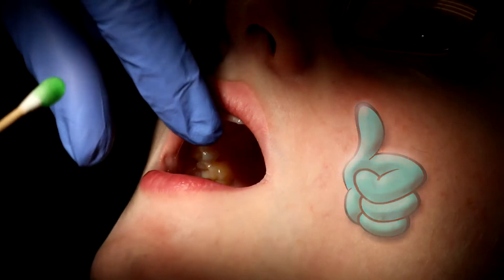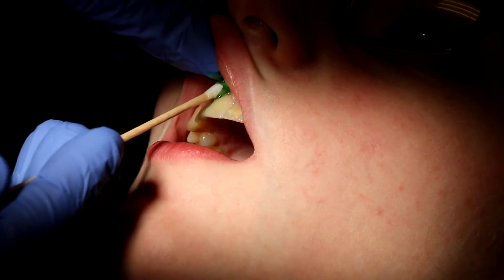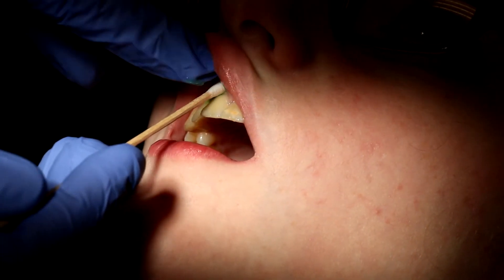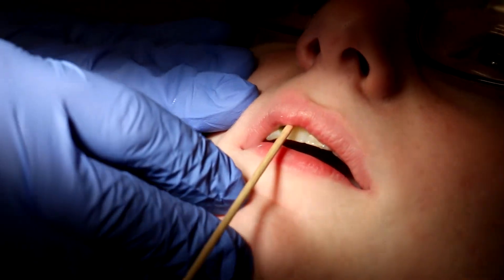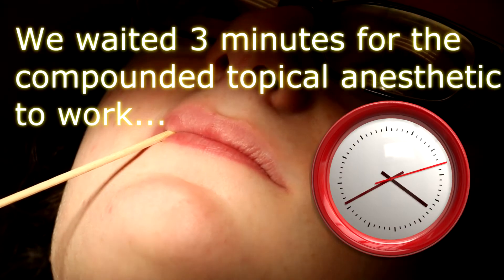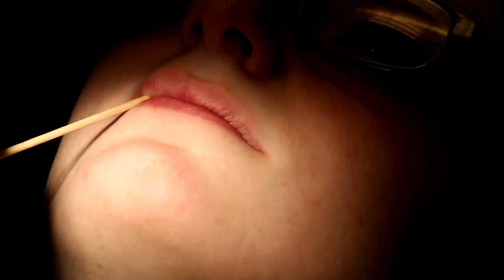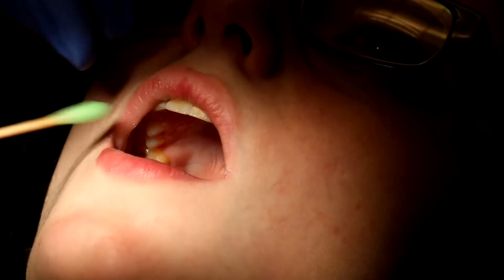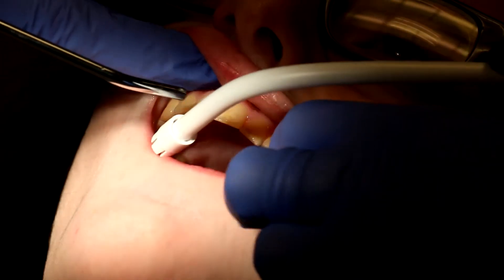All right, so you can open a little bit. Good. You can just turn a little more like that right now — just turn a tiny bit. Okay, so we're going to rinse off this very powerful compounded topical. You can open up for me. Good. Open a little bit bigger, Lily.